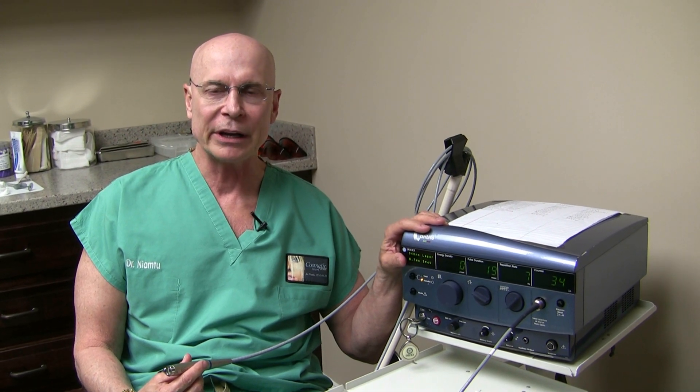Hi, I'm Dr. Joe Nyam from lovethatface.com. Today we're going to discuss the Iridex 940 and 532 laser. It's a great little platform — great for spider veins, anything red, anything brown, anything black. And we're going to do two common lesions today.